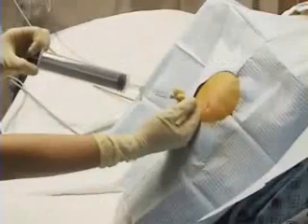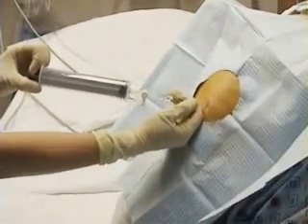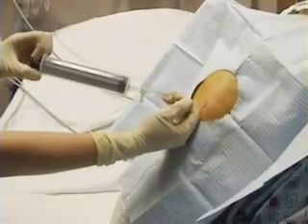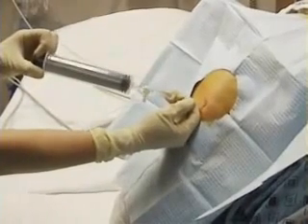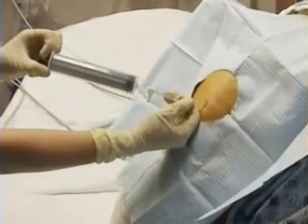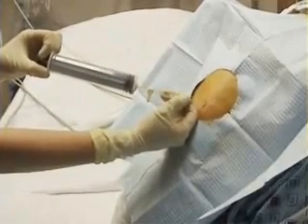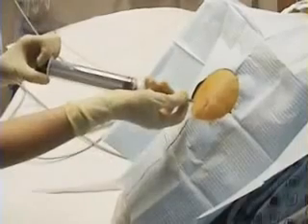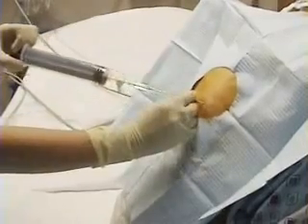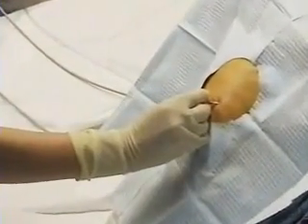Attach an 18-gauge over-the-needle catheter to a syringe and advance it along the superior surface of the rib. Keep pulling back on the plunger as you proceed to the predetermined depth of the pleural space. Once fluid is aspirated, immediately stop advancing the needle and guide the plastic catheter over the needle. When the catheter is fully inserted, remove the needle as the patient exhales or hums.